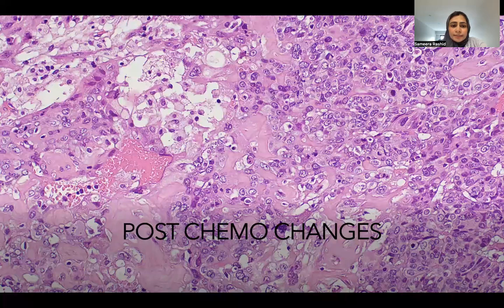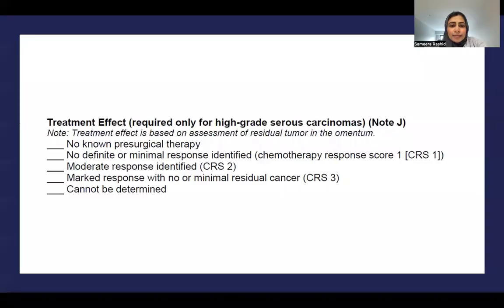Since most are advanced at the time of presentation, they are treated with neoadjuvant chemotherapy. And these are the findings we see in the treated patients: sheets of histiocytes, some hyalinization, some necrosis, histiocytes, lymphocytes, and fibrosis also in many cases. Assessing this response is extremely important because this will determine how the next stage of treatment would be.